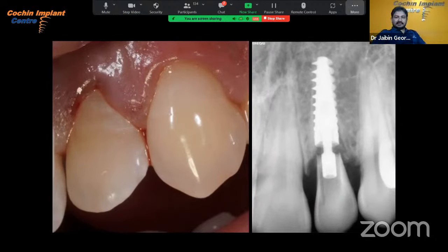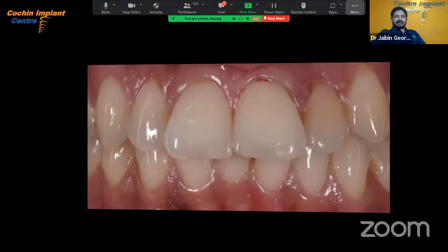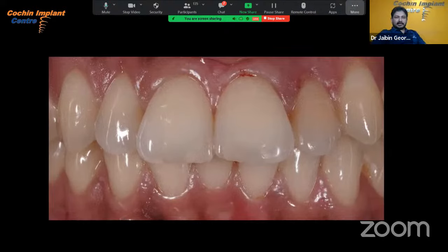And the crown is fitted onto the implant immediately after the surgery. You can see the patient reported to the practice with the fractured crown and left the practice with the same crown, but the crown is on an implant. So there is no waiting period. The patient leaves the office with the crown. That is the advantage of immediate loading.